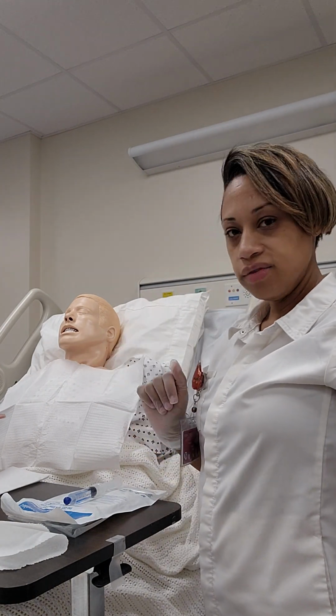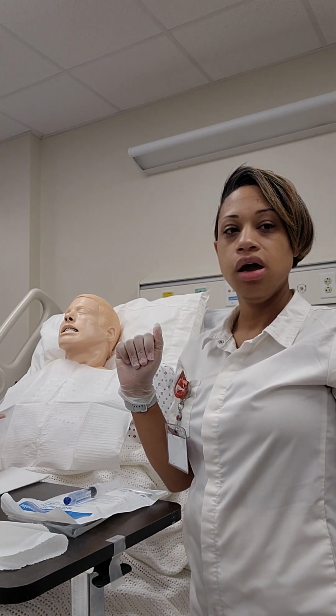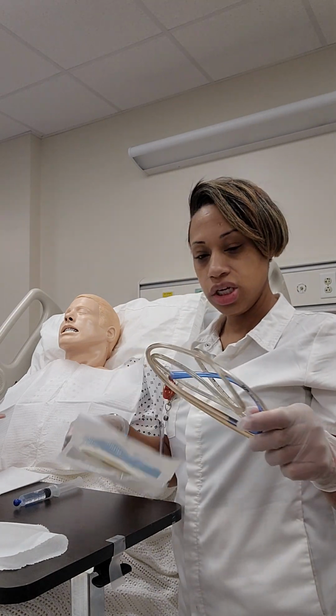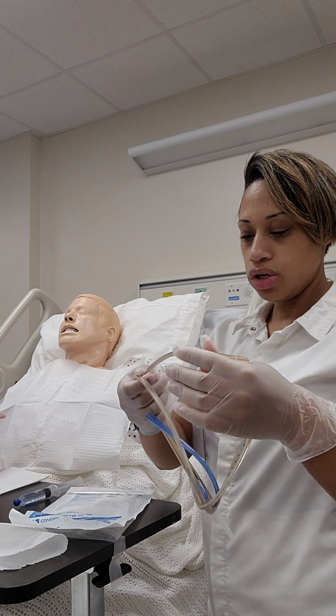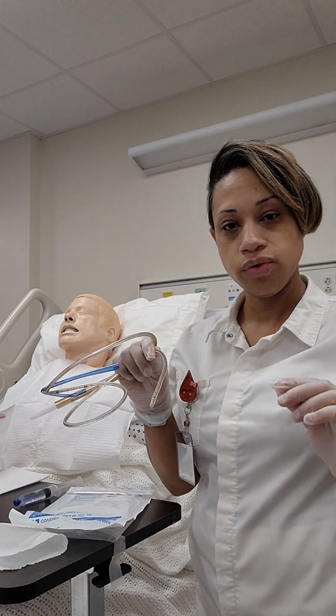Now once I have done that and checked my patency, I'm going to get my NG tubing, and then I'm going to measure. The first thing that I will do is measuring.